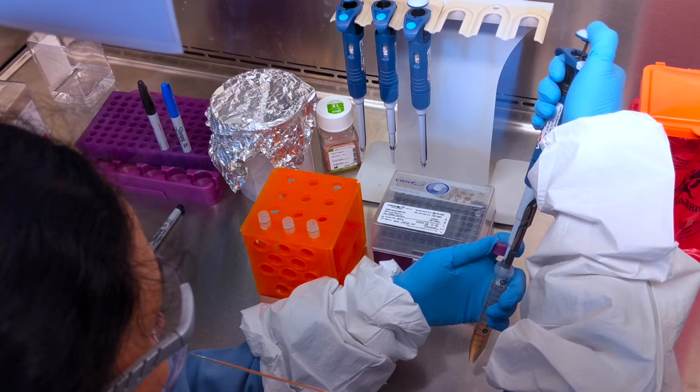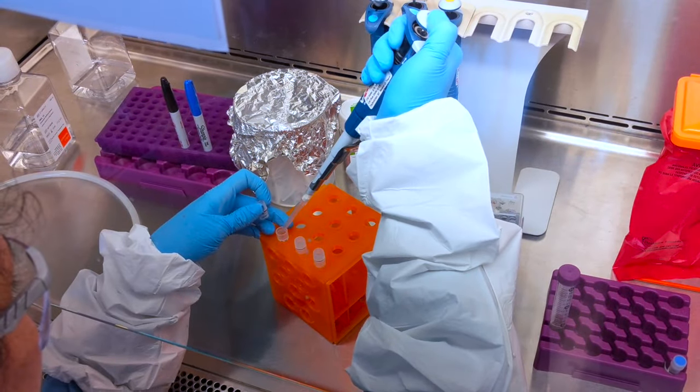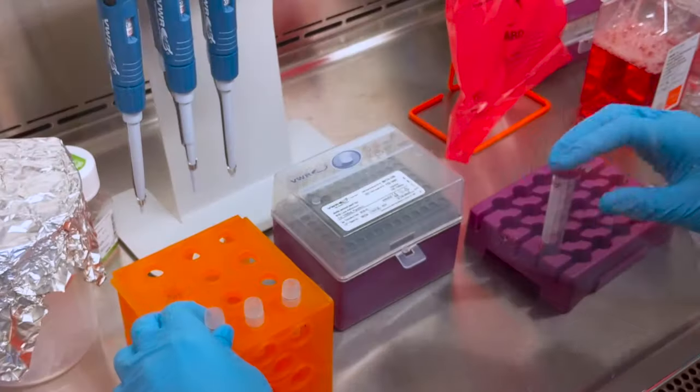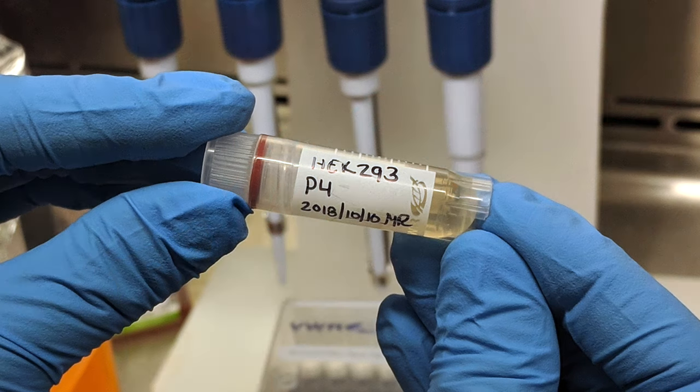Once cells are received and thawed, expand them for the first few passages until you have several flasks of early passage cells that can be prepared for freezing. Store the vials in a cryogenic freezer for future use. As you use your cell line, keep track of the passage number. Once the cells have been used for 30 or 40 passages, discard the flask and thaw a new vial of early passage cells.